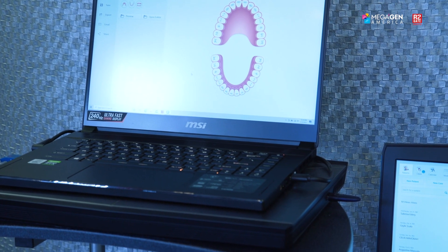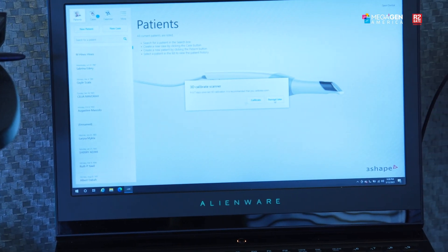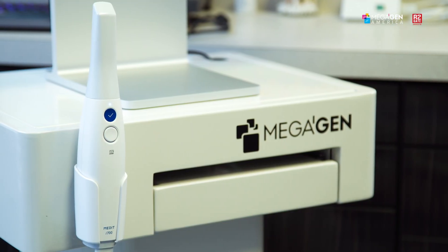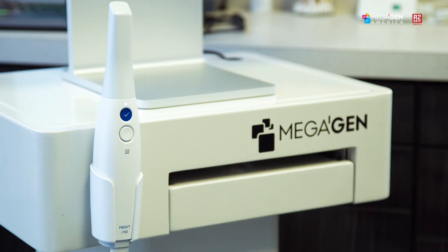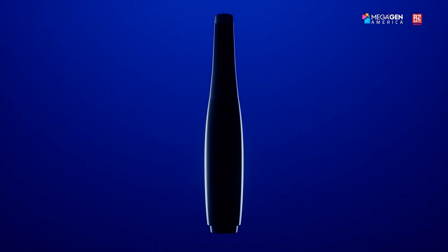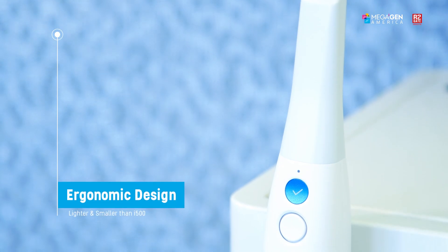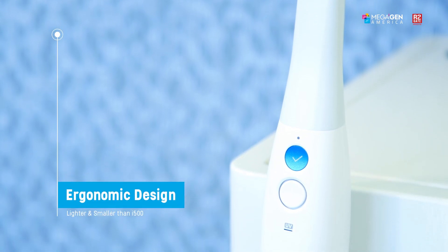One of the most fundamental portions of digital dentistry is intraoral scanning. We have a number of scanners in the office, and of course the latest addition is the Medit i700. The first thing you'll notice when you pick up the i700 is its nice new sleek design — more ergonomic, lighter, more comfortable to hold.